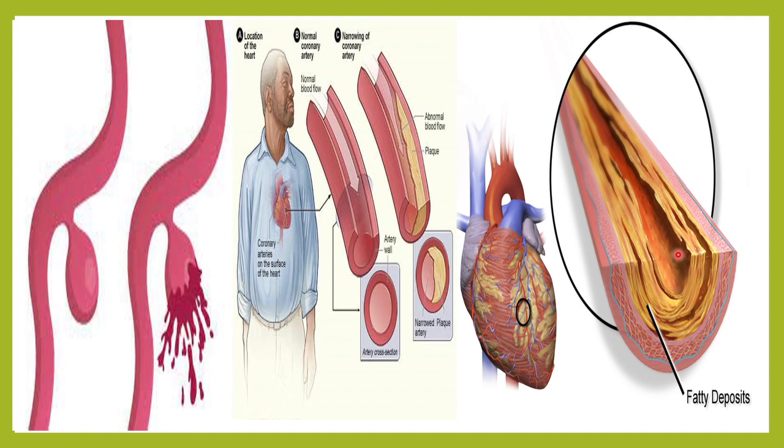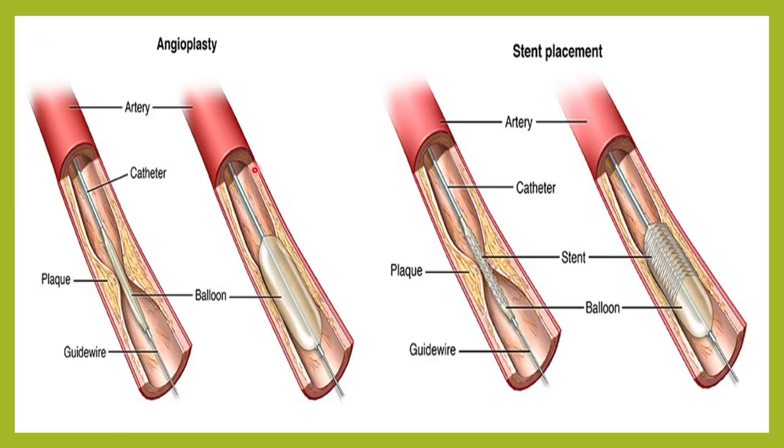Here you can see the artery which is narrowed so much, and there is very poor blood flow. You can see here very little blood flow, or the occlusion of these blood vessels, which we can make out with the help of this angiogram. So suppose there was an occlusion and the blood flow was very low, when you see the blockage, the doctor immediately, through the same process, can repair it. That is called angioplasty.